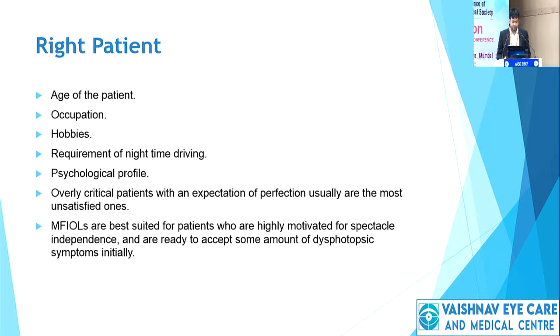The age of the patient: the younger the patient, the faster the neuro-adaptation, so the better the result. It depends on the occupation and the hobbies the patient has. A requirement of nighttime driving could be a factor which may not go in favor of multifocal, as it might cause glare and halos to the patient, which would already happen with a multifocal lens.